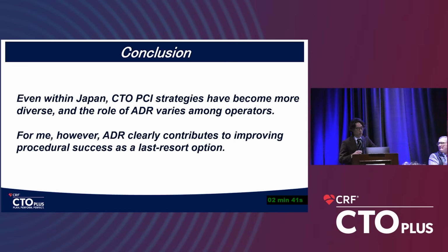Yeah. I think so. That is one issue for the confusion of IVUS guiding. Previously, Japanese operators say that the wire is here and the IVUS is here. That's why that corresponds to the angio image, and the angio image is 5 o'clock, something, and so on.